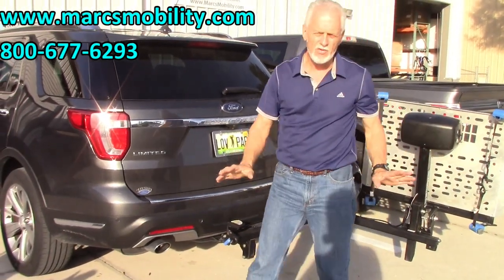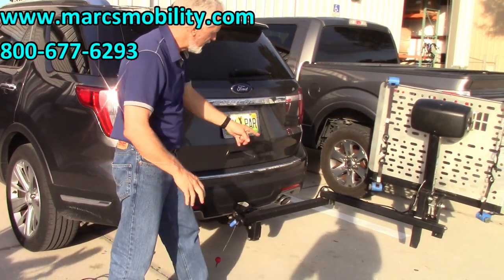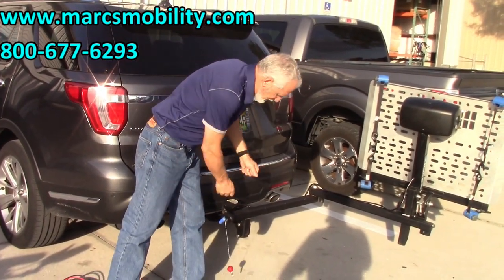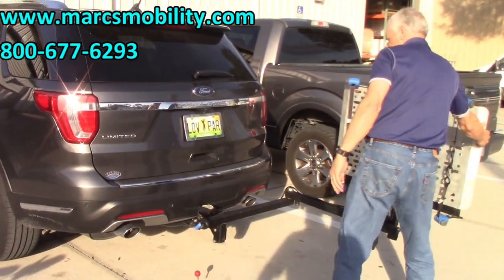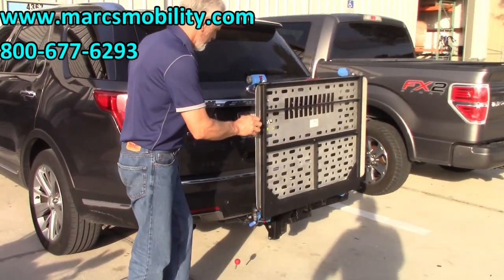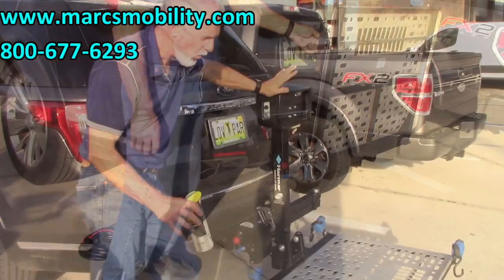Do not open the lift with the power chair on the lift. If you do that with the power chair on the lift, the swing-away will not shut properly — you'll bend the arms. This is called the swing-away right here. You put it back in, and this is a precaution pin. Put that pin in there for precaution.